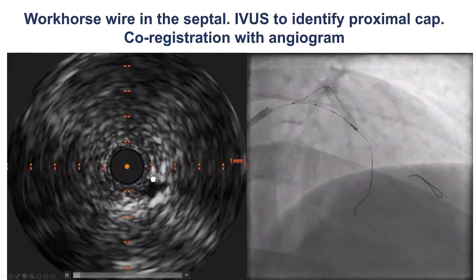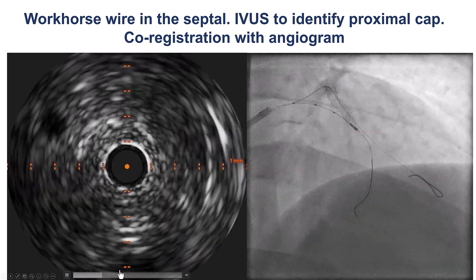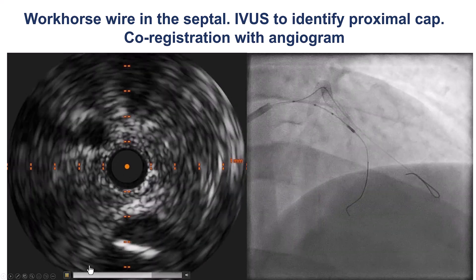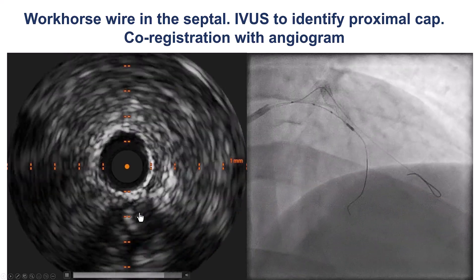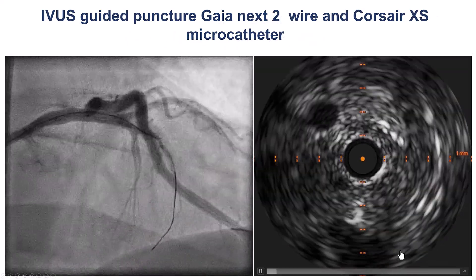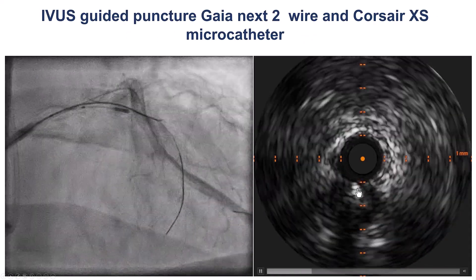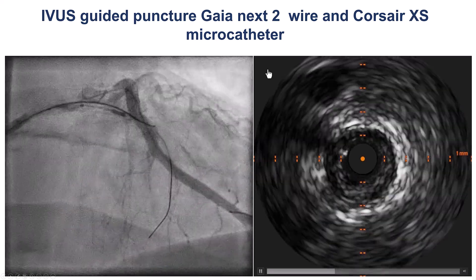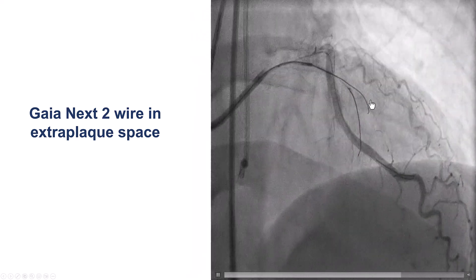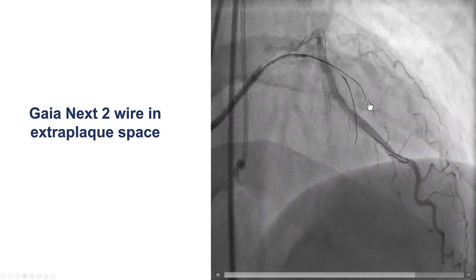We performed intravascular ultrasound after placing a wire into the second septal branch. As the IVUS pulls back, we can see the LAD chronic total occlusion, which helps identify the location of the proximal cap. Based on this, we attempted to puncture the proximal cap with a Gaia Next 2 wire, which seemed to be going into the right place. However, on ipsilateral injection, we can see that the wire is not dancing together with the vessel — it is in a different space.